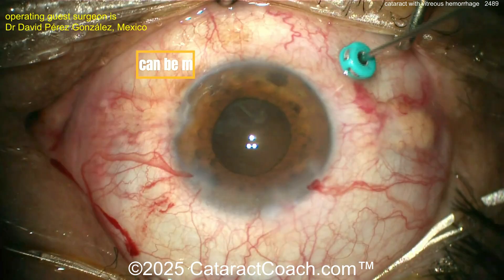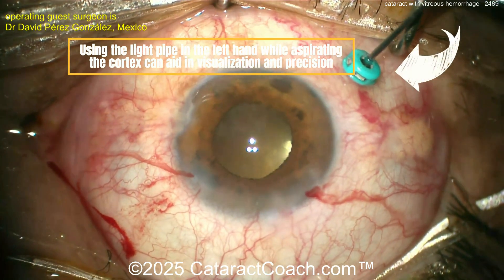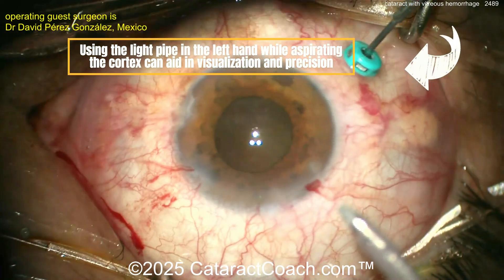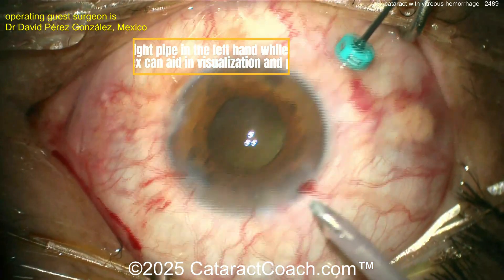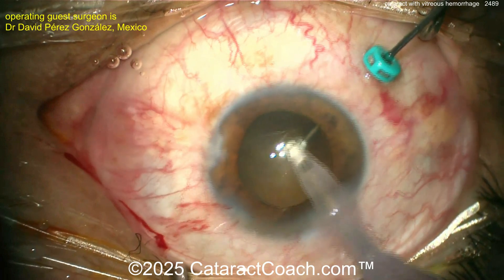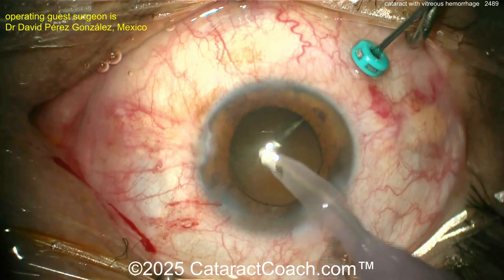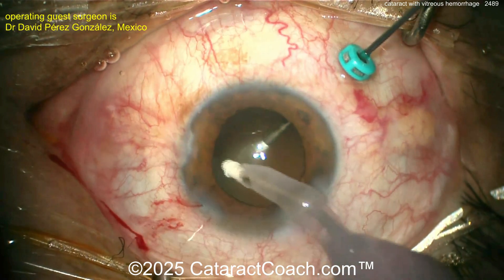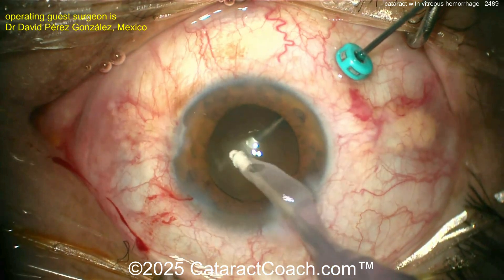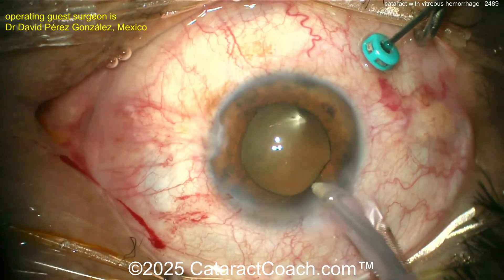The lens nucleus moves easily, but the cortex is going to be a lot more challenging. Look at this technique — how beautiful is this! With the light pipe inside the pars plana trocar, you can really light up the posterior capsule. This is a two-handed technique: one hand holds the light pipe, the other hand removes the lens cortex. Look at that — cleaning it up very nicely. You can also use a light pipe from the anterior segment through a paracentesis, but going pars plana is really neat.